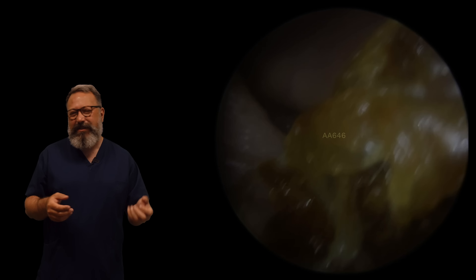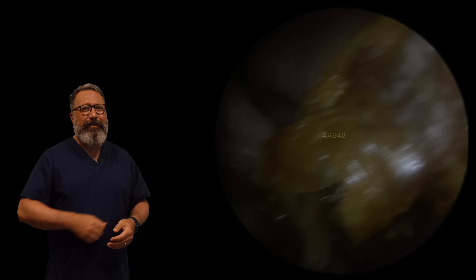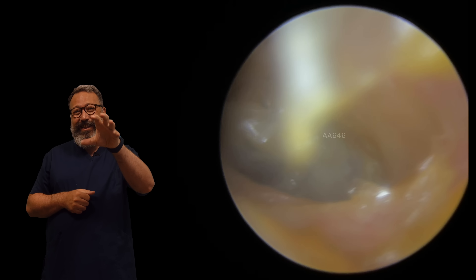That was massive. You can see why it didn't want to come out with suction - it just looked at the suction and went, 'I'm not coming out with that.' But now you're getting this out, you can see it was pretty solid.